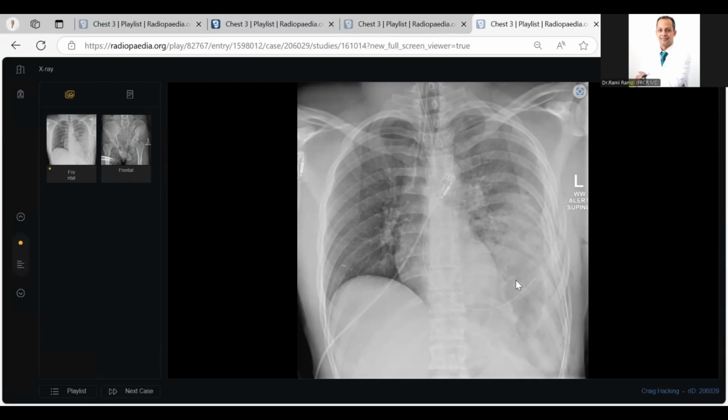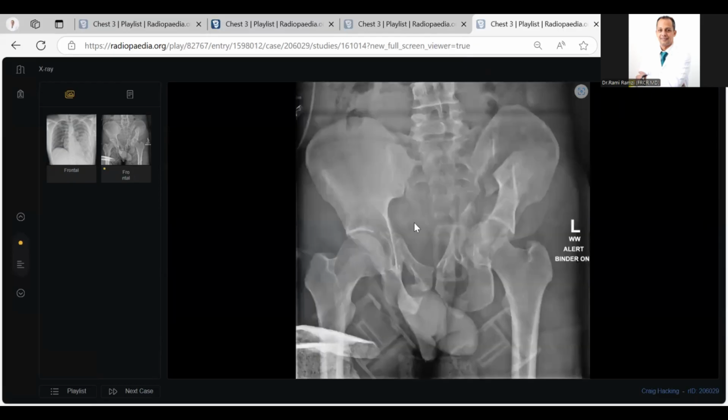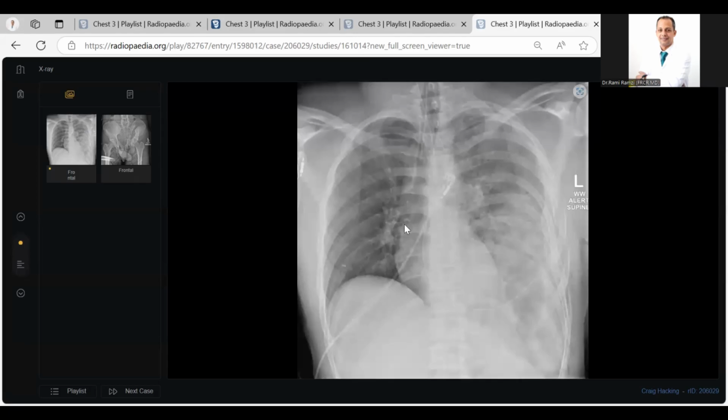This is very good. And the fracture. You asked for CT. When I showed you this, and I insisted this is a polytrauma patient, the only thing you delayed telling me is, oh, this may be pulmonary embolism due to fat embolism. But overall, Dr. Akila, you did very well.